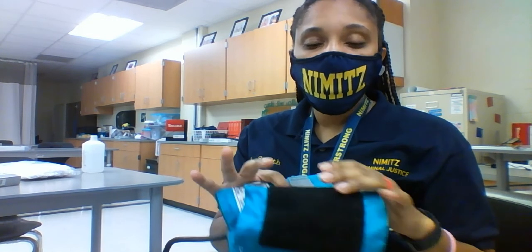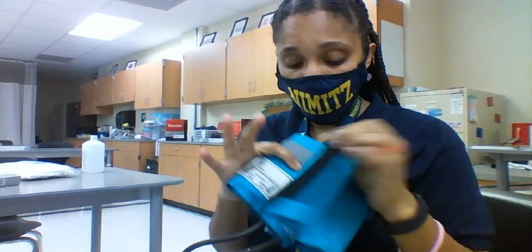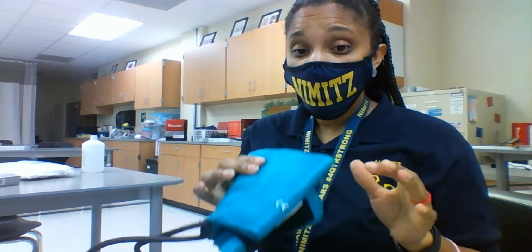But know that there are different sizes of your sphygmomanometer, your blood pressure cuff, in order for you to get an accurate read. Because if you put a small blood pressure cuff on a larger arm, it's going to read as if they have high blood pressure, and that's not necessarily true. It's the pressure of this cuff being too little, which is going to give you a false reading.